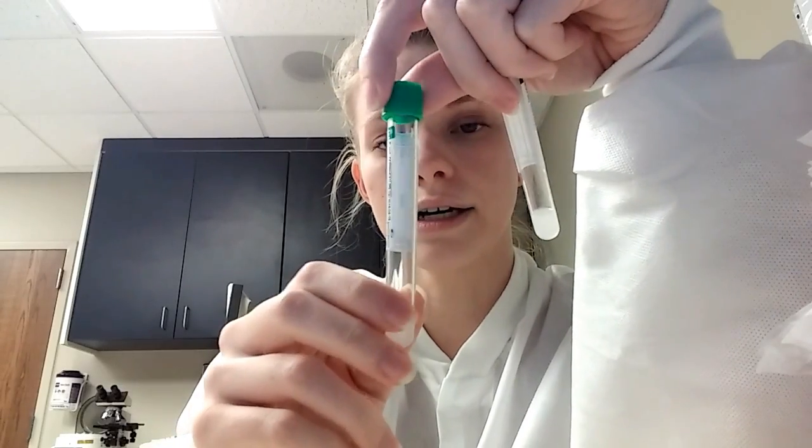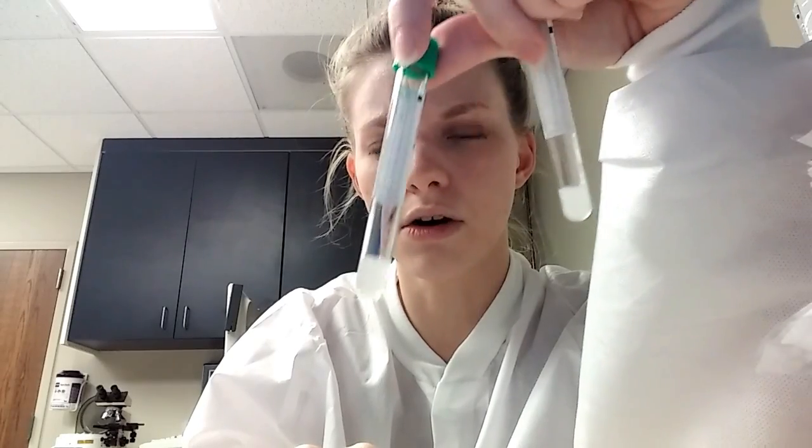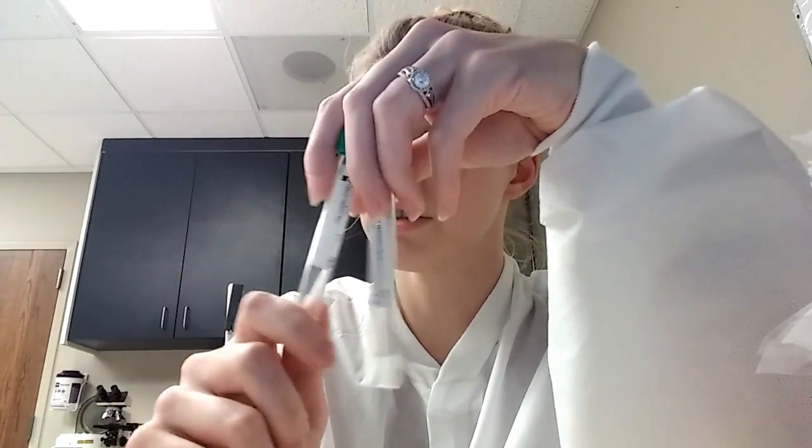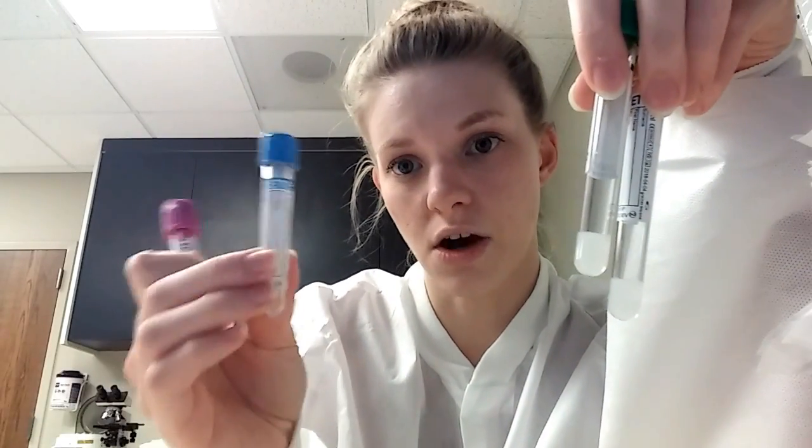The green tube is plasma — plasma is actually the same thing that ends up on top in a purple tube when you spin it down, but these have gels that separate them for you, which is nice. The green tube is where we run most of our chemistries. We also run our troponin off the green versus the gold, just because that's what it's calibrated on. Troponin is a heart marker. You can run your liver enzymes and electrolytes off this one as well, though most of those you can also run off the gold. These are chemistry tubes; the purple is hematology, and the blue is the coag tube.